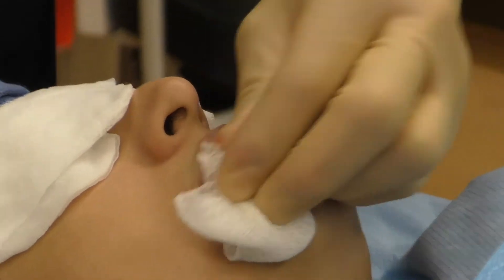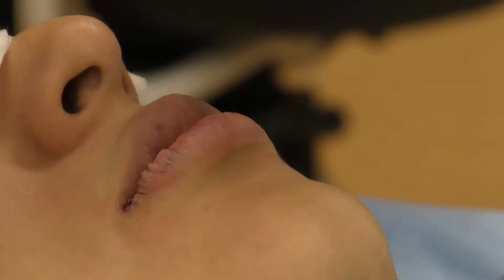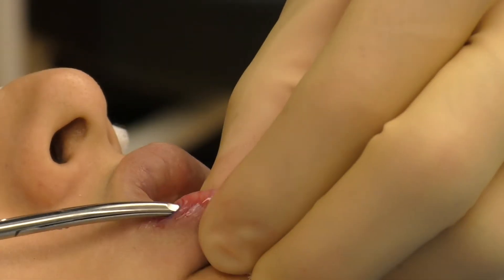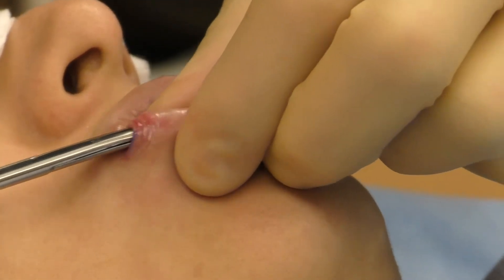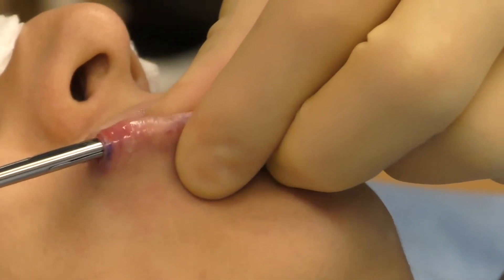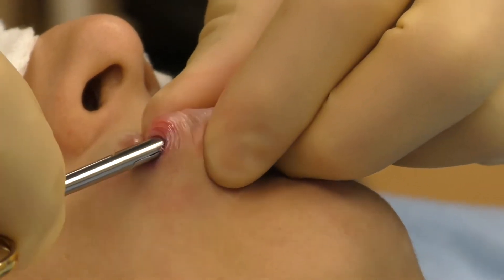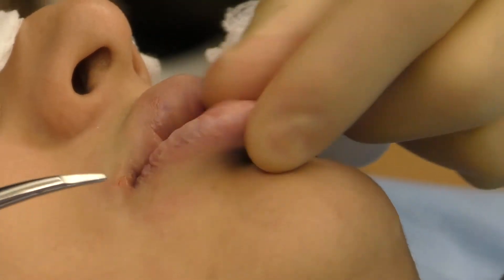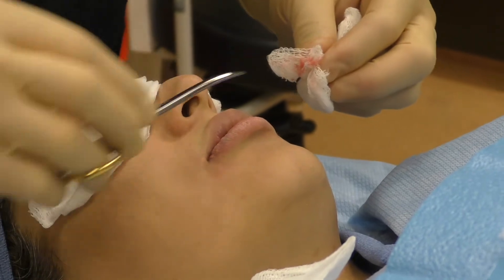I have the patient here, prepped on the table. I've already made a small incision at the corner of the mouth. I'm looking at the corner of each side, then we'll take some scissors and start doing the dissection for the implant. The dissection goes right above the muscle — the orbicularis muscle — that's the muscle that purses the lips closed. So you're not in the muscle or under the muscle like you would be with a breast implant; you are on top of the muscle. You want to make sure you're at the dry portion of the lips, not the wet portion. I'm pretty much at the midline right there. I'll stop and pull the scissors out and do the same from the other side, and the same on the top lip as well, so that we have that tunnel made.